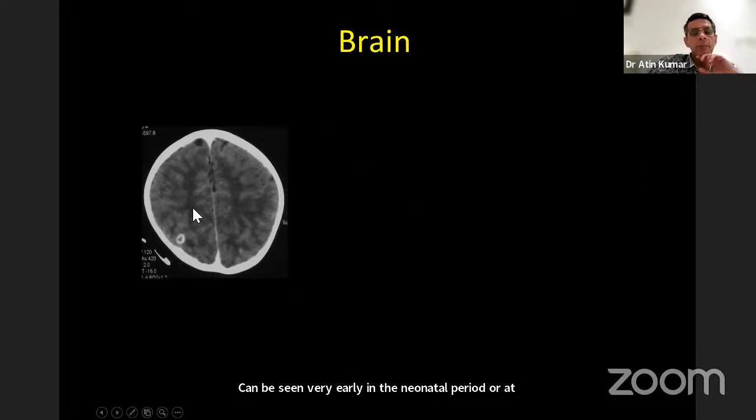Okay, let's see some more examples. A CT scan image. In this, there is some abnormal hyperdensity seen almost as a ring-rounded structure on the right parietal lobe. There is nothing here, so this is not a normal thing. Is this contrast or is this plain scan? This is of course a contrast scan.